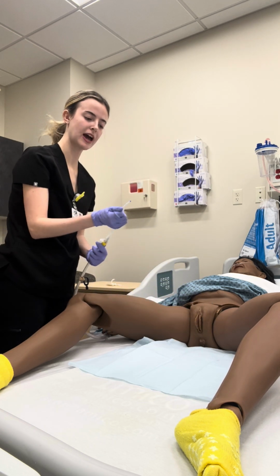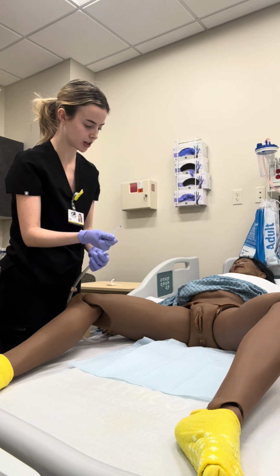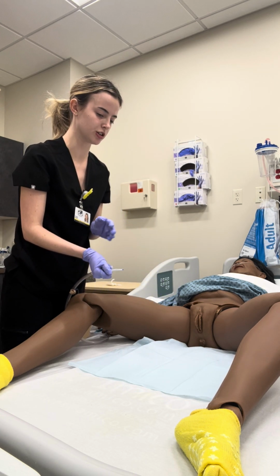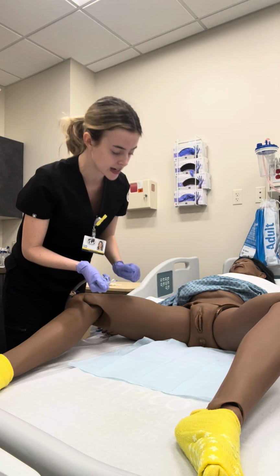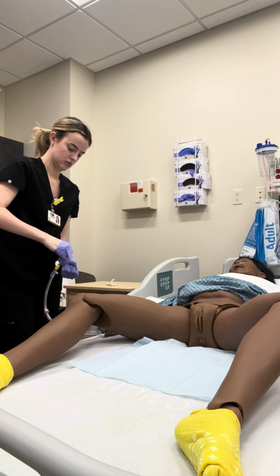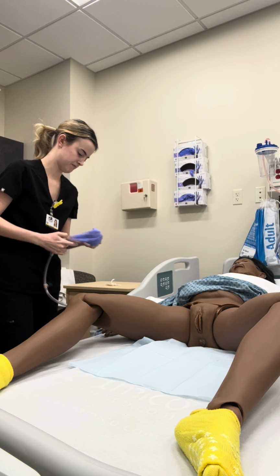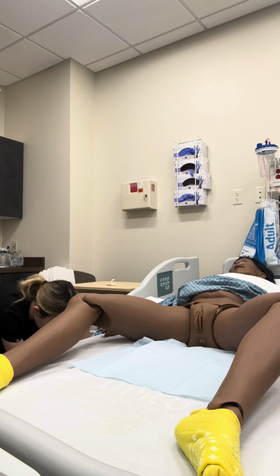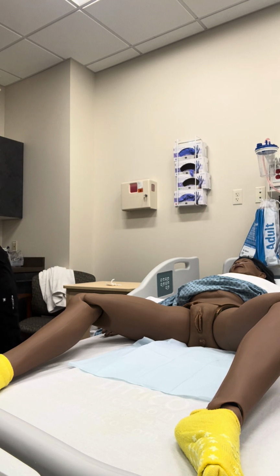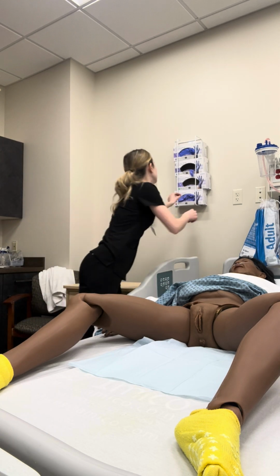Okay, and I'm checking the catheter, making sure that it's still intact. It is, the integrity still looks good. And then I'm also looking at the urinary meatus, making sure that it all is still intact. It looks good, no abnormalities there. I will just wrap this up in my glove. And throw this all away. And then I would put on gloves again.